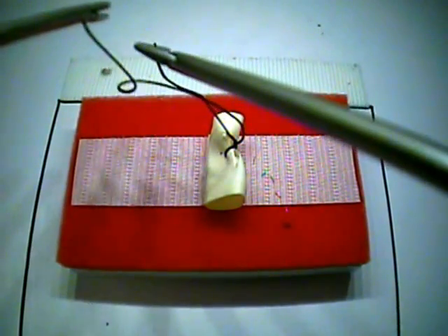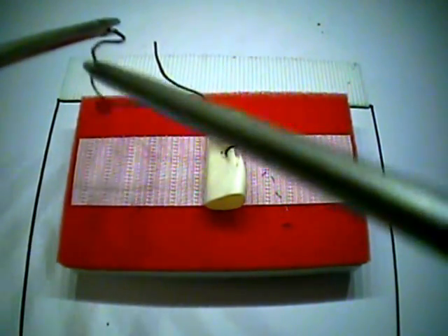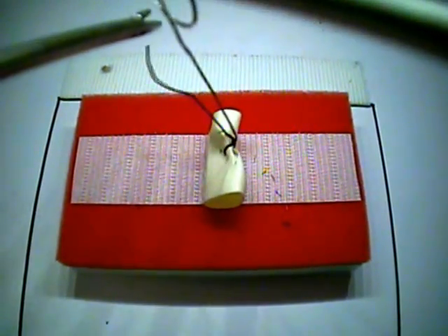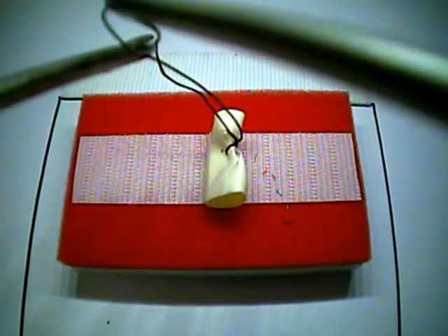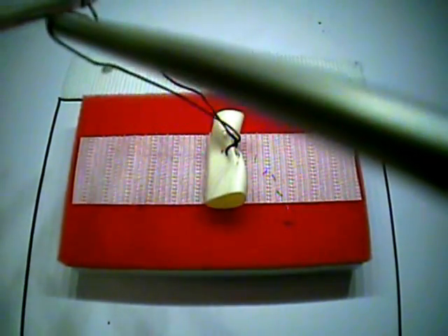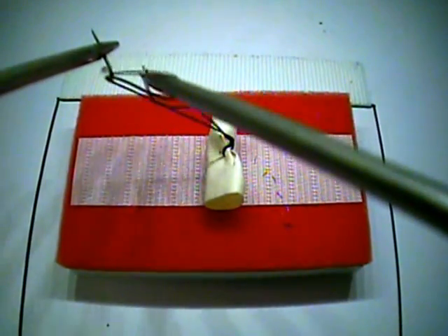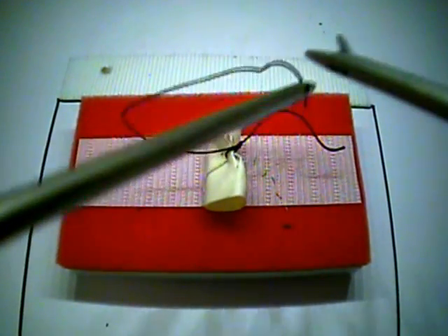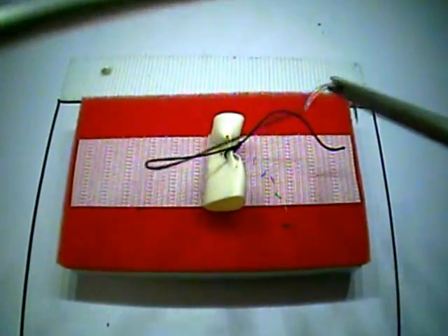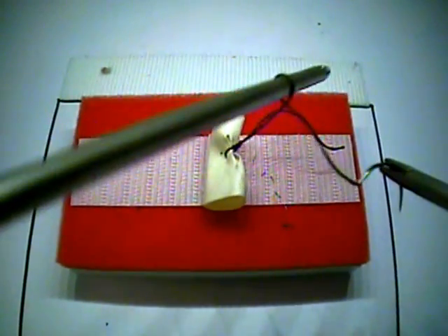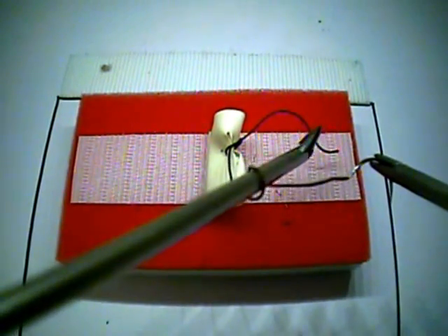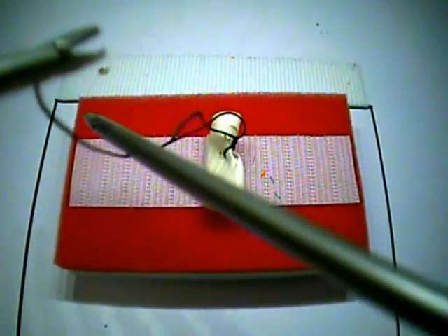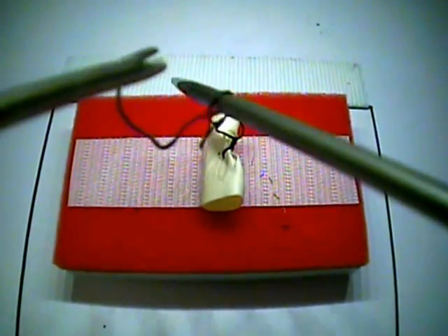you may find it more efficient to continue repeating the tying steps, so that you get more practice out of each available suture and each available throw of the needle through the Penrose drain. This process can be repeated until the suture is too short to perform any more practice throws.